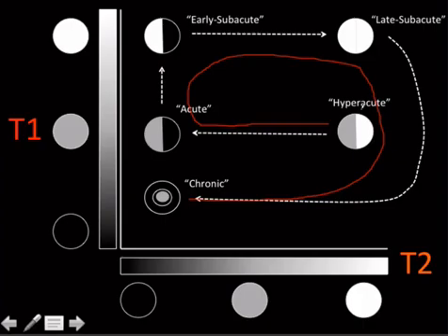And then once you do it, for practical purposes, just remember that the one that's T1 bright is subacute, and the one that's not T1 bright but is also T2 bright, in other words the ISO T1, bright T2, that one's the hyperacute one. And if you've got that, then you pretty much got it done. Or you can just Google it every time. That's what a lot of people do, even neuro attendings, just look it up, because it doesn't come up that often, honestly. But for the test, draw the spiral.